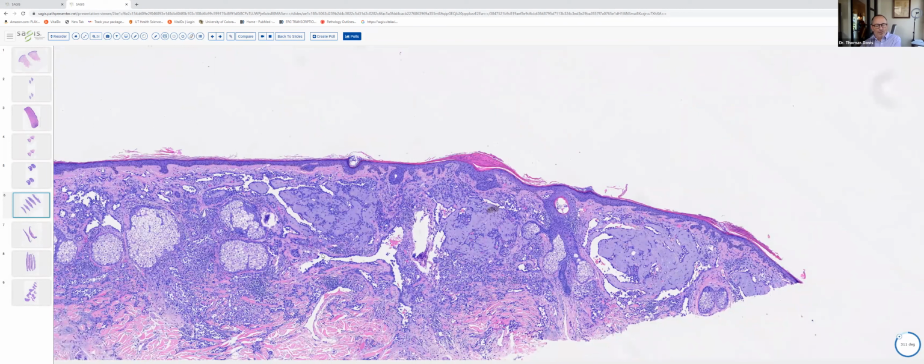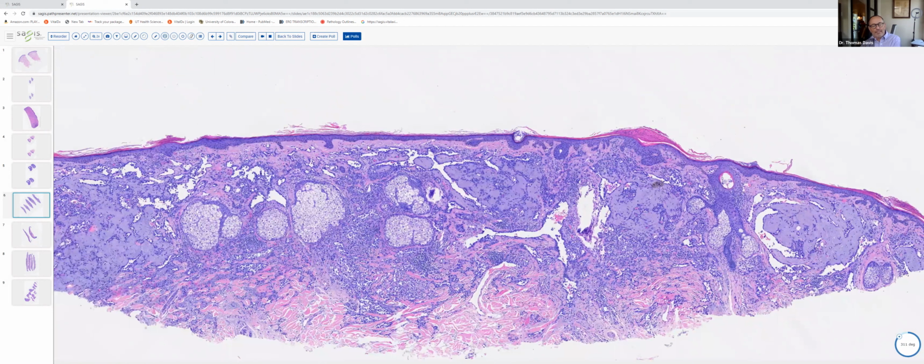These neoplastic vascular channels have actually been likened on scan, a metaphor that's used sometimes, as lightning strikes. And I do think they have irregular shapes. They do kind of resemble lightning strikes. Much more cytologic and endothelial atypia in angiosarcoma than, say, in Kaposi's sarcoma. And think about it, angiosarcoma has pretty characteristic clinical settings in which it tends to occur.